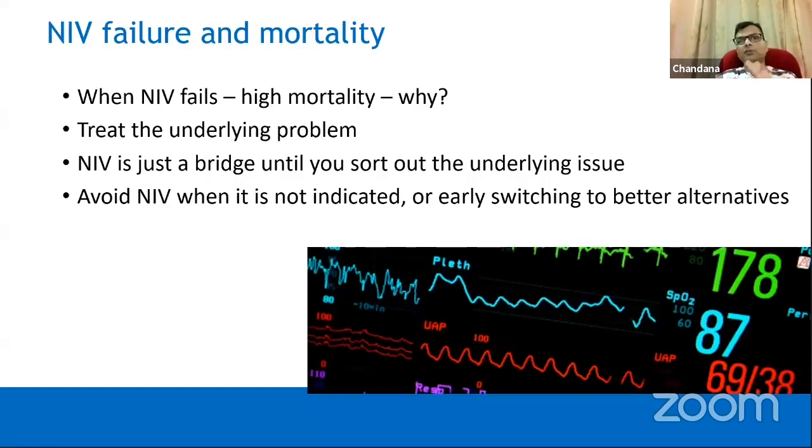Although it provides less oxygen, probably the patient feels better, and it might recruit some of these alveoli, and it might even increase saturation. As I told you, it's the EPAP and the FiO2. The non-rebreathing mask has no CPAP or EPAP, but it will increase oxygen. The respiratory device cannot provide enough oxygen, but it will provide EPAP, so it will recruit some of the alveoli.